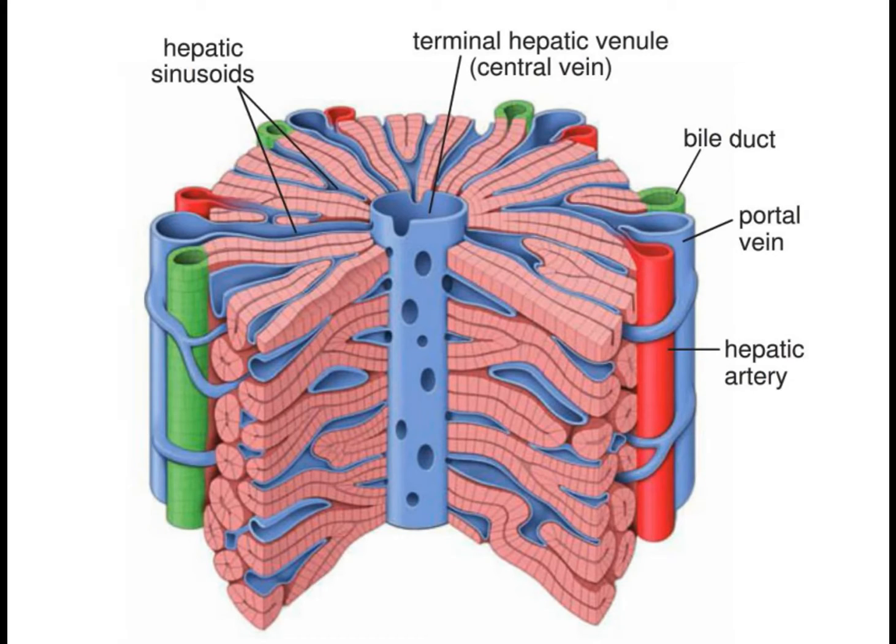Actually, kind of yes, it's kind of true, if you're healthy. You can donate your liver and it will be reproduced, but not in the same way as the tail of a reptile; it functionally increases in size and can cover the function of the rest of the organ. But here we have cells of the bile duct, and here hepatocytes. You see, their origination is similar.